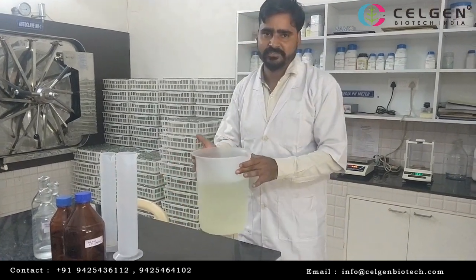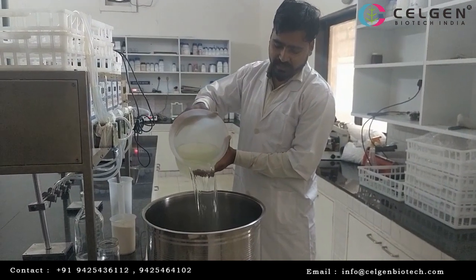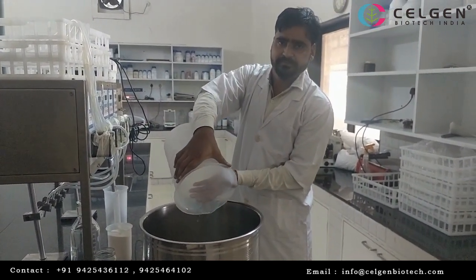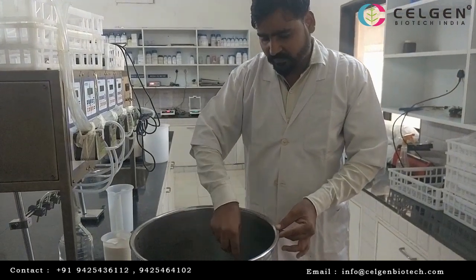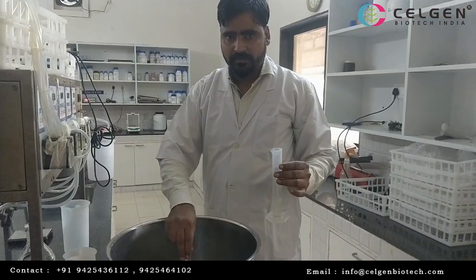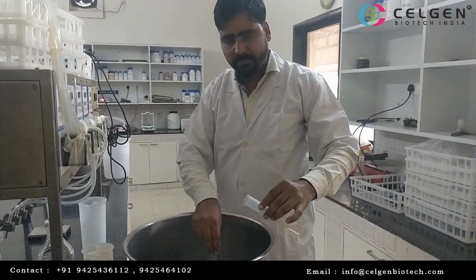Now we are going to pH. In pH, we will use NaOH. We are going to pH check.